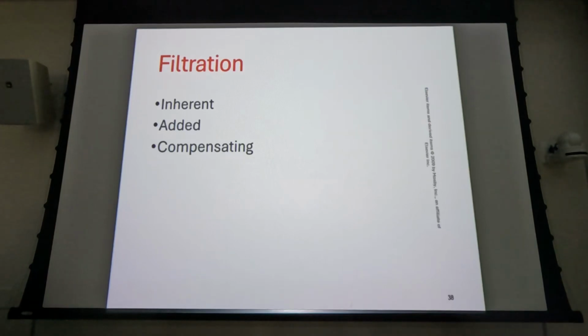In pediatric hospitals, they might want to filter the beam even more than the 2.5 millimeter minimum to reduce patient dose. The higher the average energy, kind of like kVp, the higher the kVp, the less absorption in the patient, the safer the beam is for the patient. Or filtration, remembering that filtration is one of the first things we use to minimize patient dose. If we increase the inherent filtration, the beam becomes more safe, right?